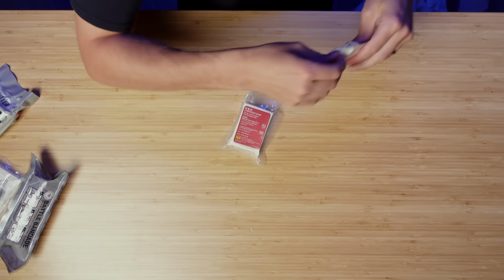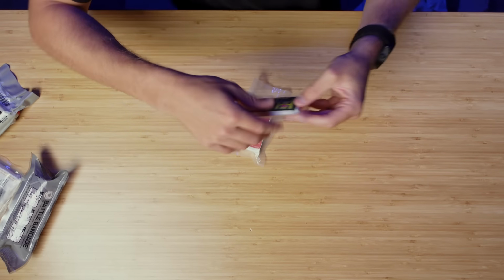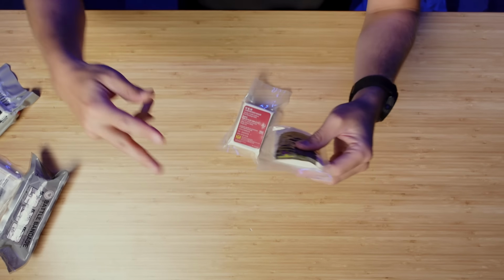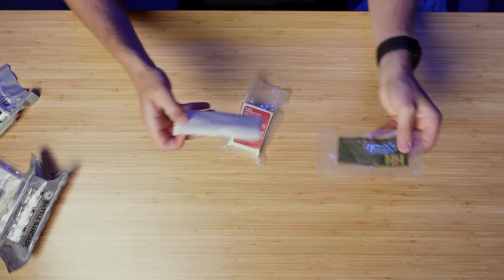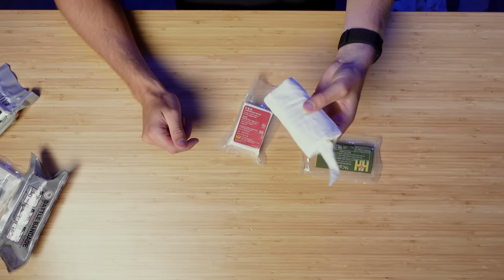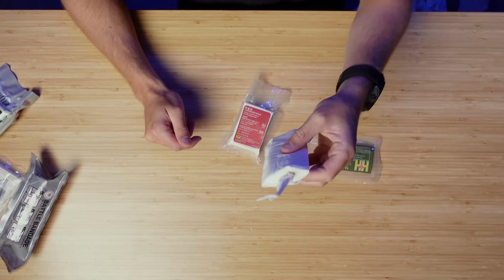You open it at the top and then you can reach in and pull it out. Once again, these things don't open very well from anywhere else. I've definitely gotten stressed on scenes and ended up cutting these packaging with trauma scissors because my stupid brain can't figure it out. All right, so my understanding with this gauze is you can do it two different ways.